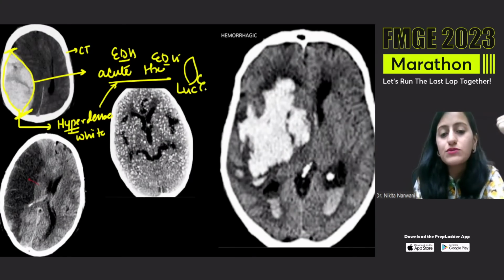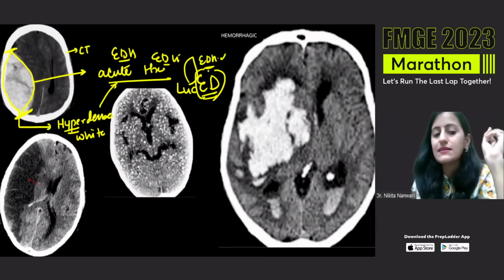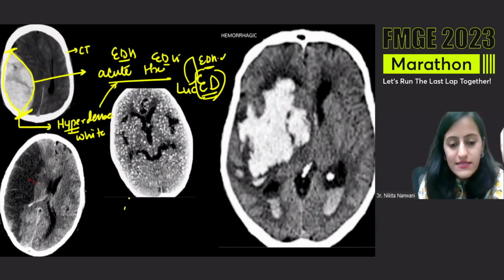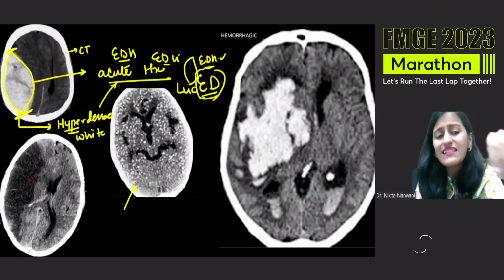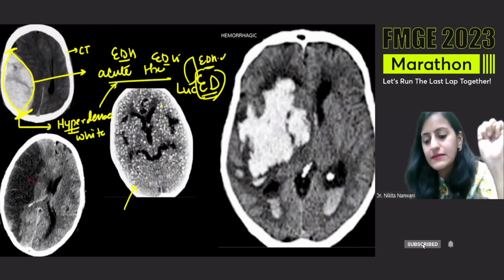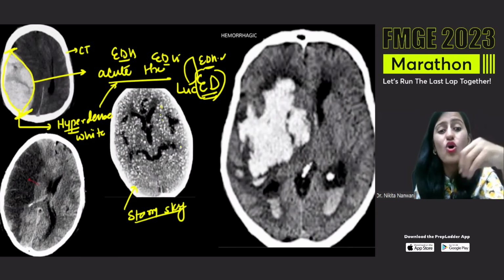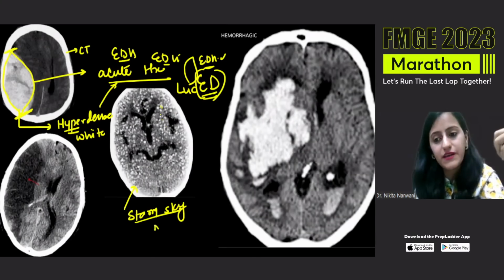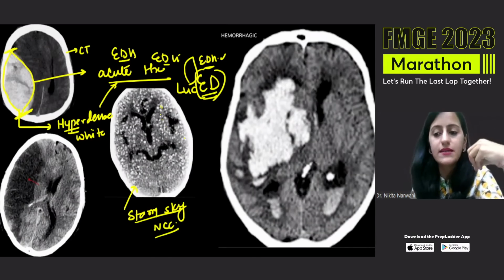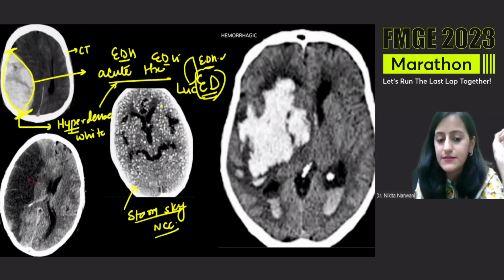We see the lucid interval. Remember, lucid interval is seen in EDH. Again, a recently asked question, right? What is this image showing? In the CT scan, those multiple white areas, this is starry sky appearance, which is all the scattered calcifications. That is neurocysticercosis, NCC, starry sky appearance, right?